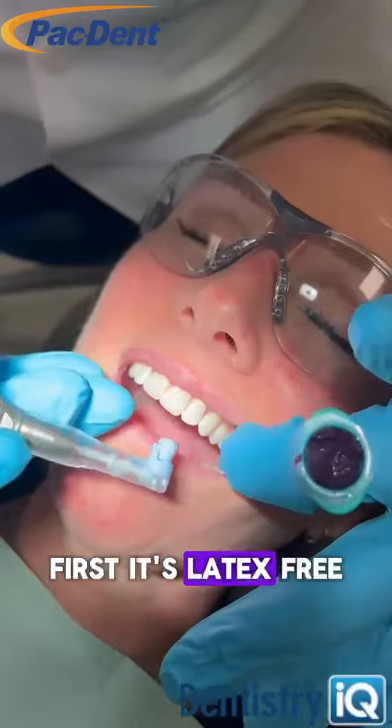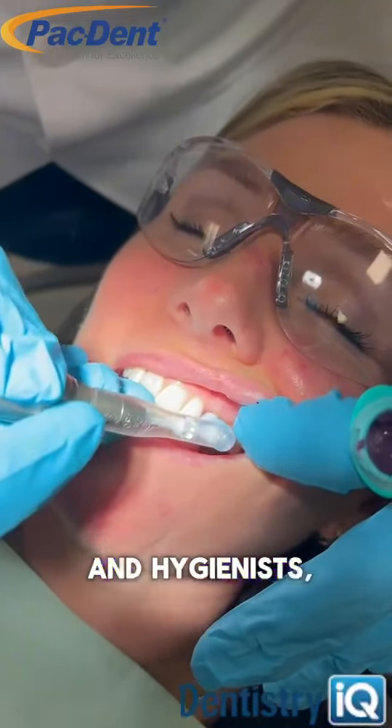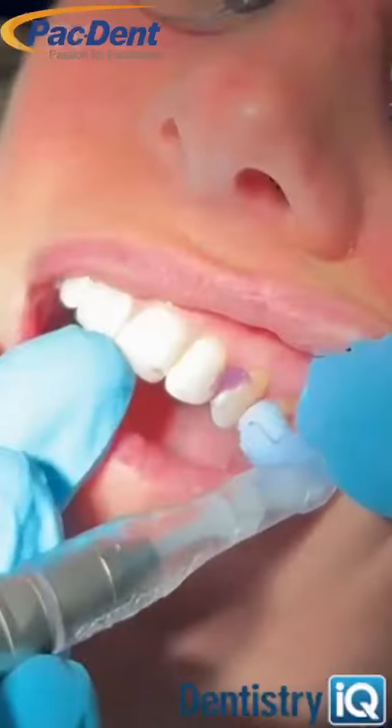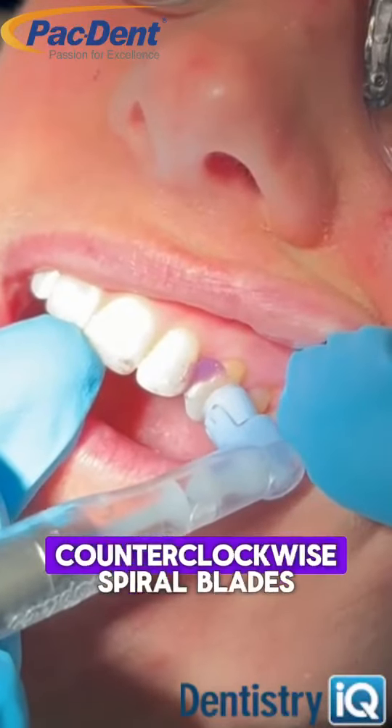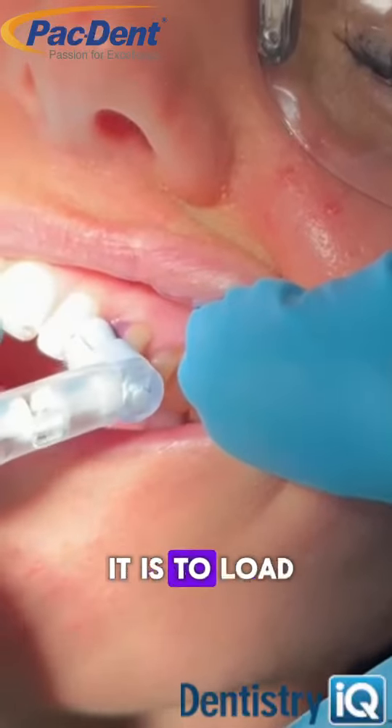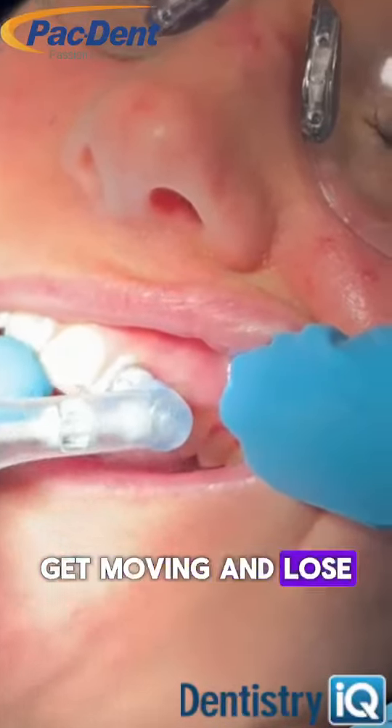First, its latex-free prophy cup is transparent — and hygienists, I know you know how critical it is for you to see. Second, the prophy cup's counterclockwise spiral blades excel at retaining your paste. I know how frustrating it is to load your paste, get moving, and lose it.